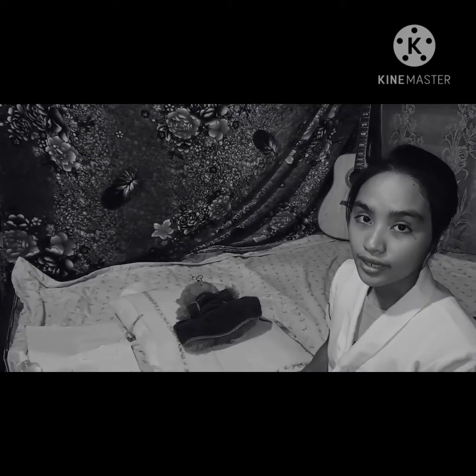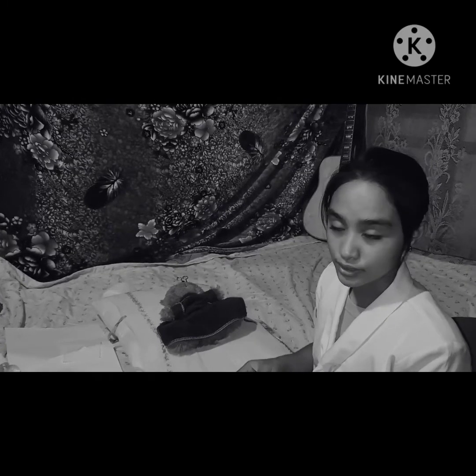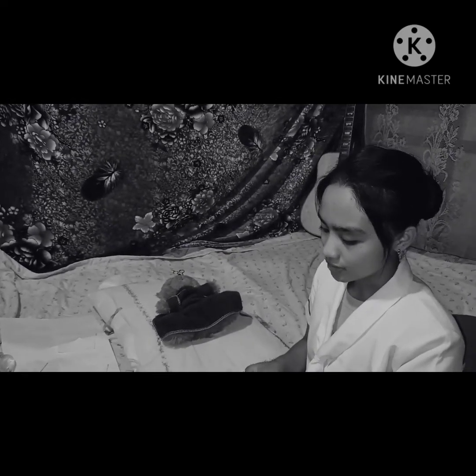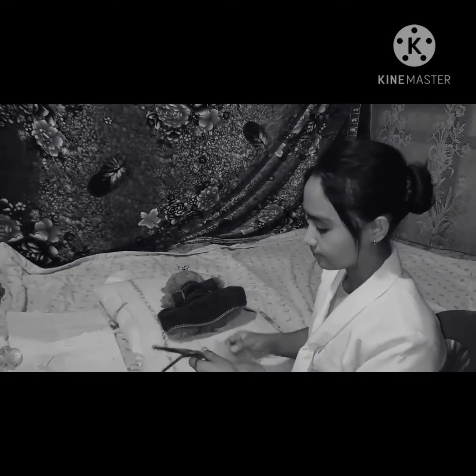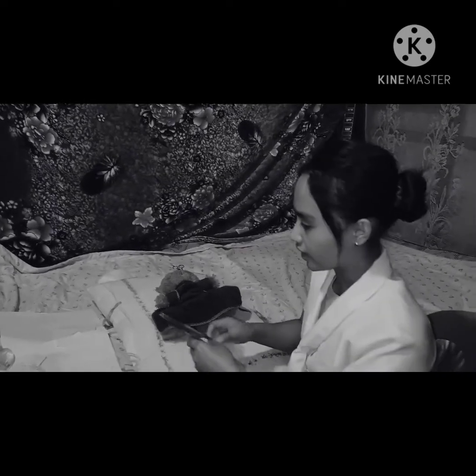Now I have to perform the procedure, but first I am going to look for the expiration date of the catheter, and if the catheter is expired, I must not use it. So the catheter is not yet expired.